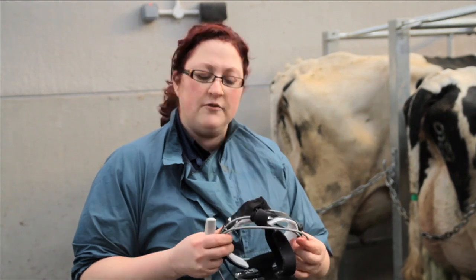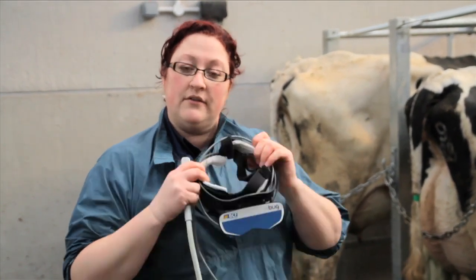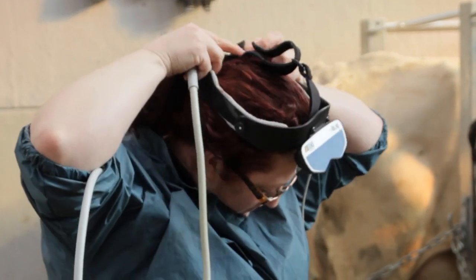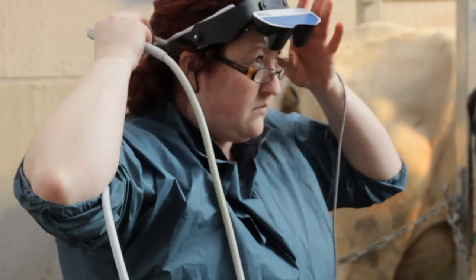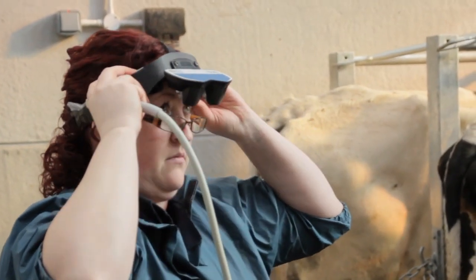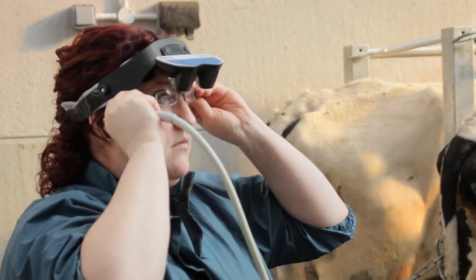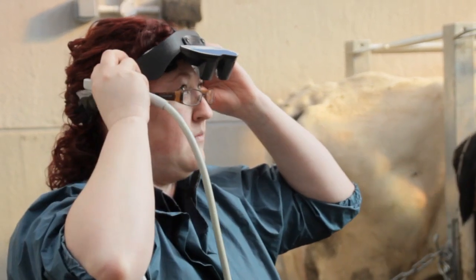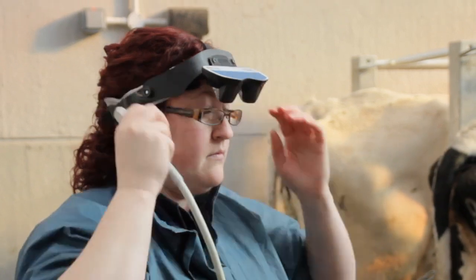As previously discussed, we do need to have some form of actually viewing the image. In this particular case, with this machine, what we'll be using is a set of goggles that actually shows us the image right before our eyes. What these goggles will allow us to do is actually view the ultrasound image while retaining our peripheral vision. This is important in a farm environment to ensure, again, safety.